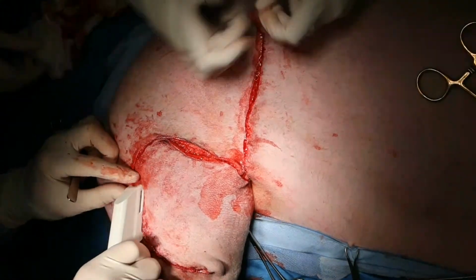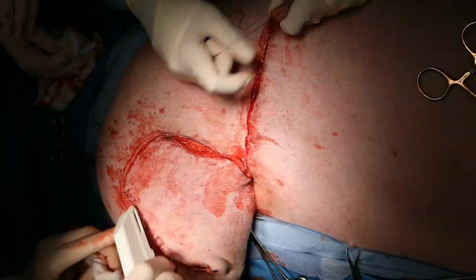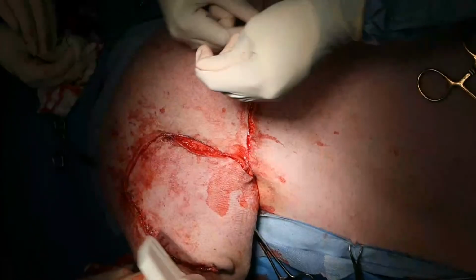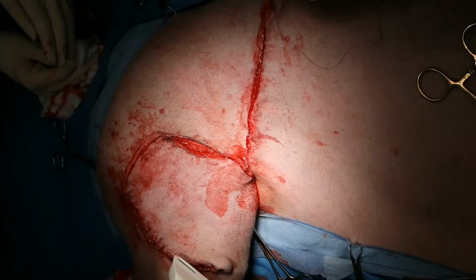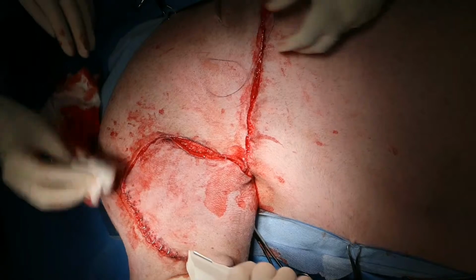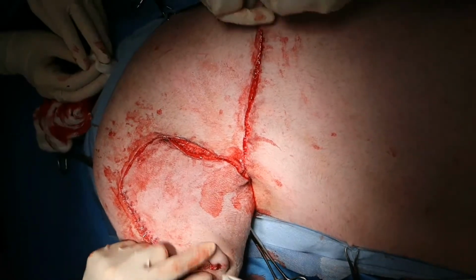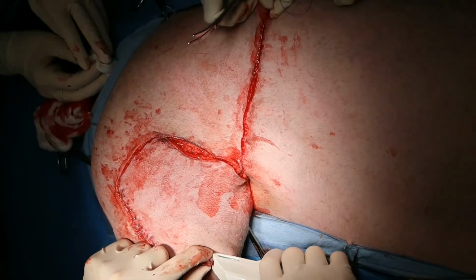All right, so come down from this direction first, and when you're using skin staples you want to make sure that the skin is thick enough that it'll fill the staple. Otherwise, the staple kind of wobbles on the skin, and it doesn't provide a good seal. And you want to push down as you staple to get more skin, because they're made for human skin, and human skin is thicker than dog skin in a lot of places, on the belly and stuff like that.